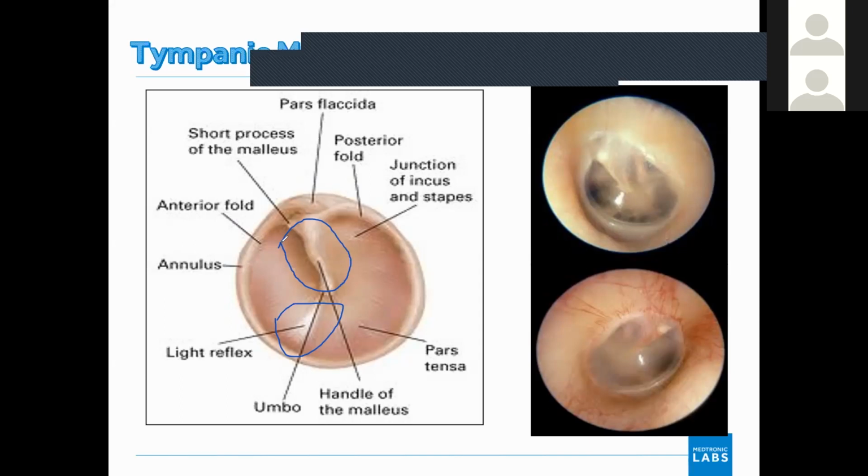So you can say 11 o'clock and 7 o'clock, it is the left ear. And 1 o'clock and 5 o'clock, it is the right ear. This is the way you have to remember things, then only you can correct them, even after the field workers made some fault.